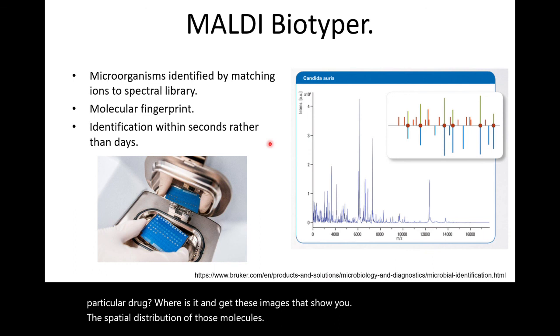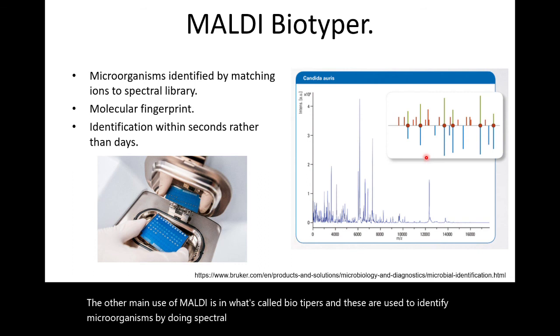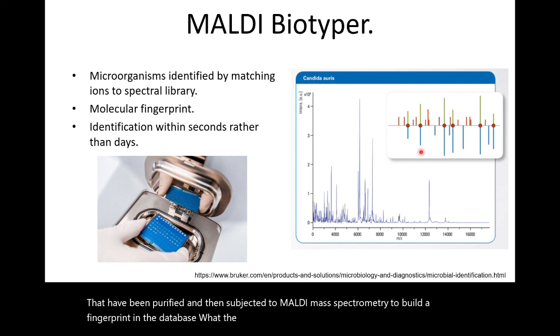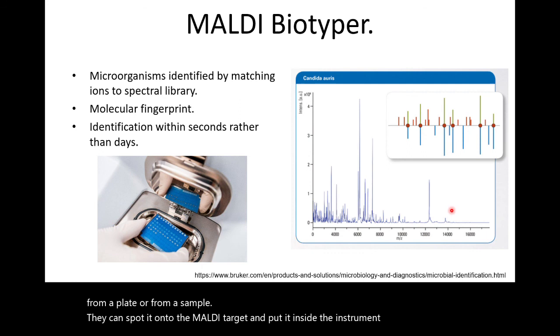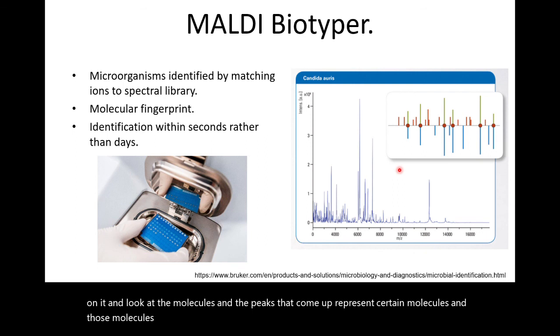The other main use of MALDI is in what's called biotypers. And these are used to identify microorganisms by doing spectral matching, where you have a database of organisms that have been purified and then subjected to MALDI mass spectrometry to build a fingerprint in the database. What the pathologist can then do is isolate a colony from a plate or from a sample. They can spot it onto the MALDI target and put it inside the instrument and do time of flight on it and look at the peaks that come up, which represent certain molecules, and those molecules are unique to that organism. And therefore, you can match the peaks from the sample to the reference database to identify what the microorganism is.